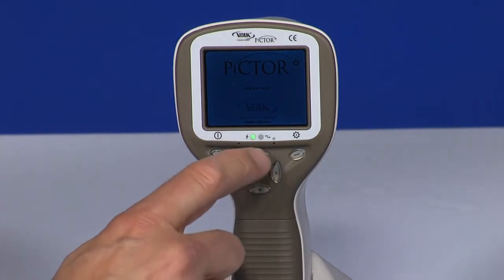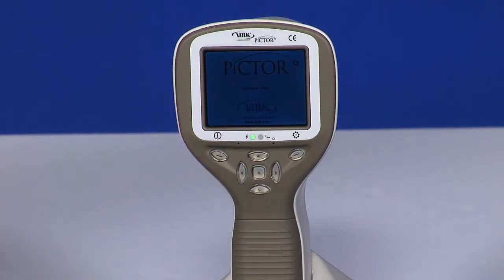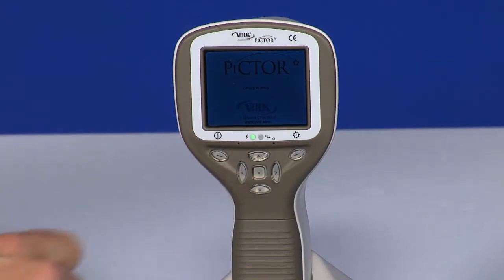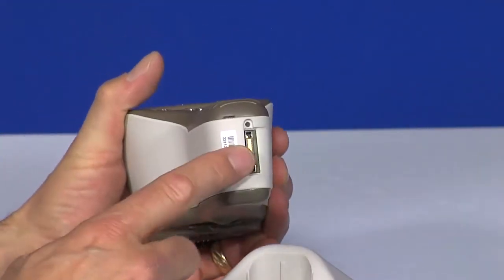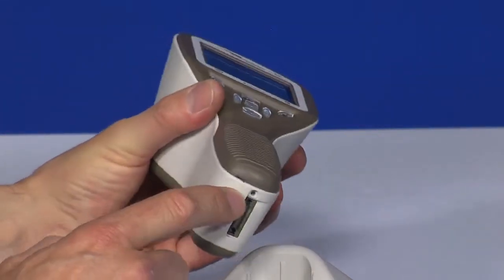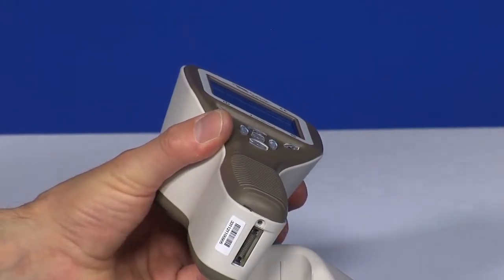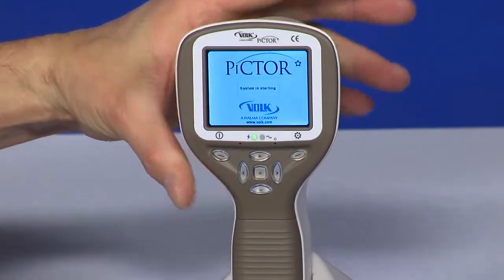The arrow keys adjust the settings when in the menu. The middle key is used to create a new patient folder by pressing and holding. The system connector on the bottom of the handset connects into the cradle. The battery and the SD memory card are accessed through the snap-in cover. Note: it is important that the SD memory card is completely inserted, otherwise the device will not power on.